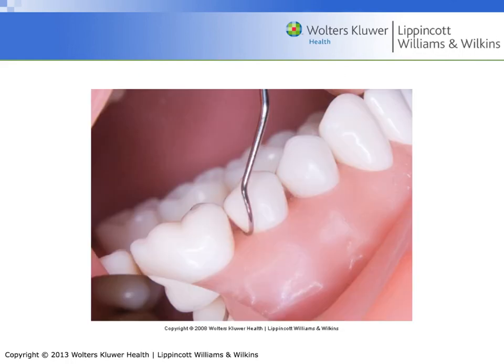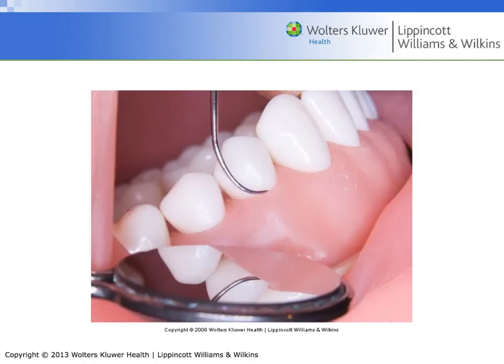She's using the correct end of the Explorer, and the working end does appear to be correctly adapted. Here she's using the correct end of the Explorer and has the tip third adapted to the tooth as well.